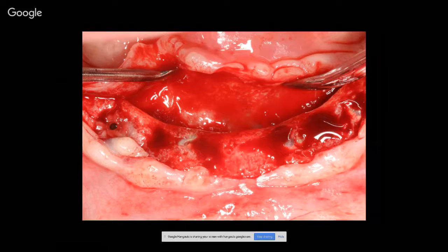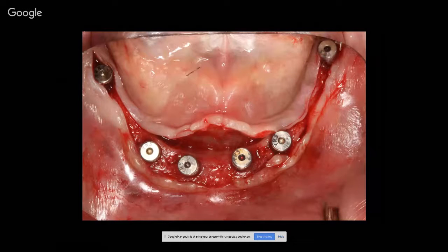So now my main focus is to thicken the soft tissue. And this was just a proof of concept. This has been further developed to what I'm doing now. What I did essentially was ask the patient if he wouldn't mind going without teeth for a few days. He said that would be fine. I placed on healing abutments, allowed the patient to heal, and then had him come back in a few days.